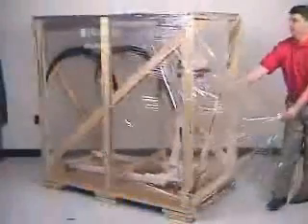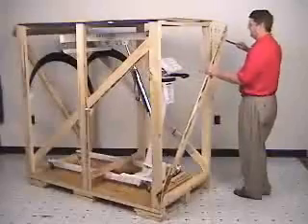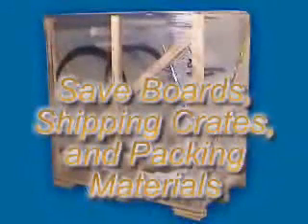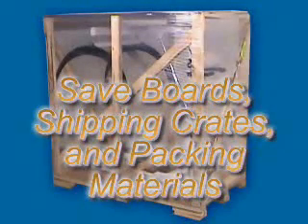First, with the use of a pocket knife, carefully remove the protective plastic from around the crate. Next, with the crowbar, pry the diagonal brace board from the end of the crate, then the stabilizing boards behind the unit's back wheels. An important note: save boards as they are removed, along with the shipping crates and packing materials, in case the unit has to be returned to the factory within the first two to three weeks after receipt.